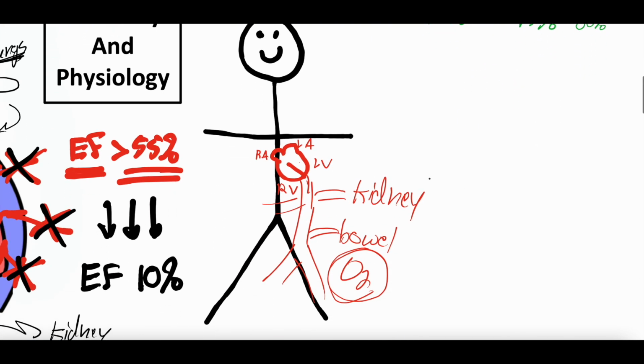If we go down to our terrible drawing here, this is the aorta, and the aorta pumps blood to the rest of the body. So the LVAD has part of its tubing here. It sucks blood out of the left ventricle. It goes to a nice pump, and that pump then shoots that blood through another outflow cannula directly into the aorta, so that the oxygenated blood can go and get to the rest of the body.